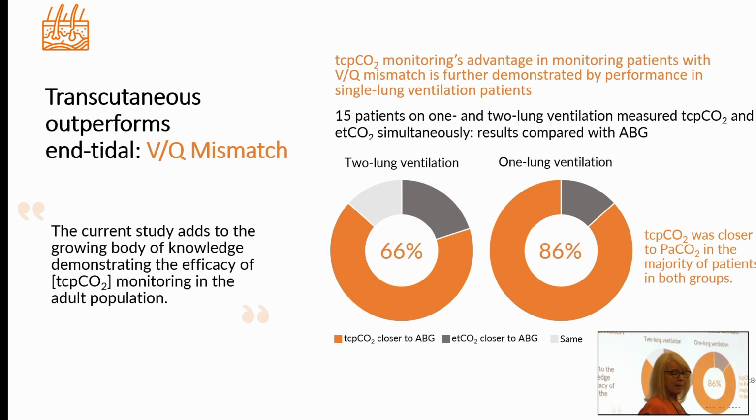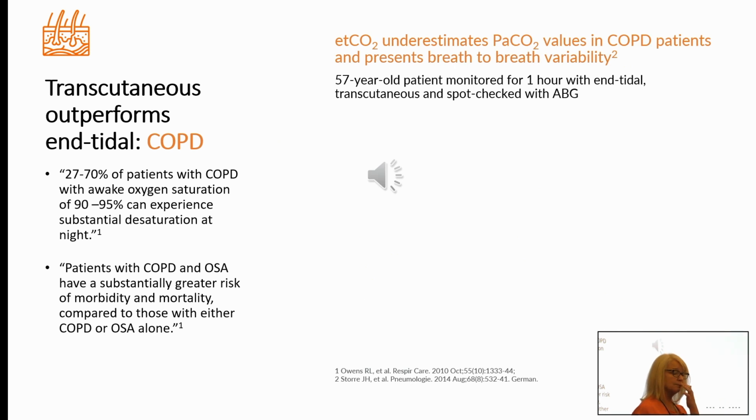So in this study, they compared the transcutaneous values and the end-tidal values to the blood gas. Those patients who are on 2 lung ventilation, the transcutaneous value was closer to the blood gas 66% of the time. But those patients who are on one lung ventilation, so those with a severe VQ mismatch, the transcutaneous CO2 was closer to the blood gas values 86% of the time. So that made a huge difference in that particular patient population. Now, it's also been shown to outperform end-tidal in patients who have COPD, of course, another VQ mismatch scenario.